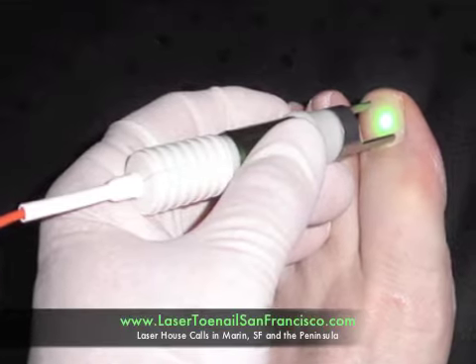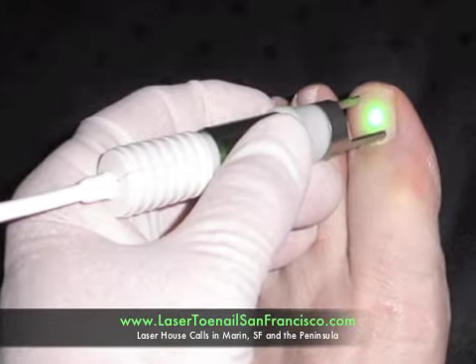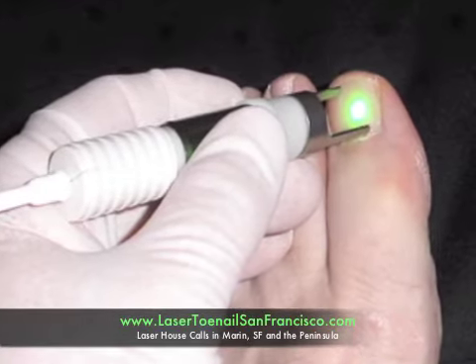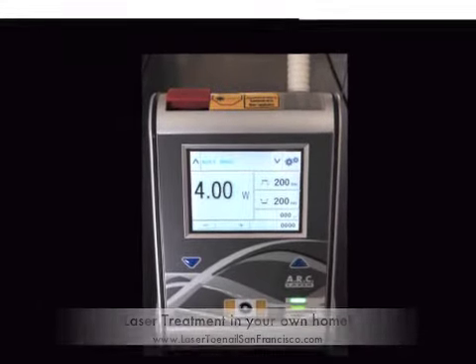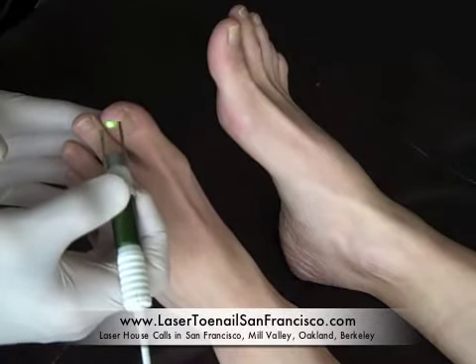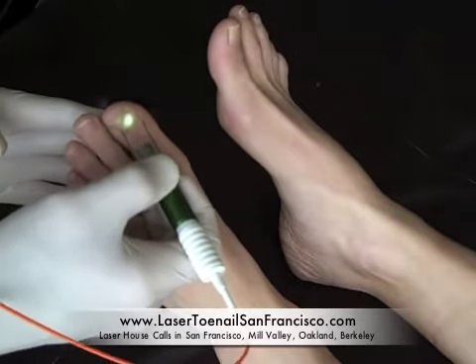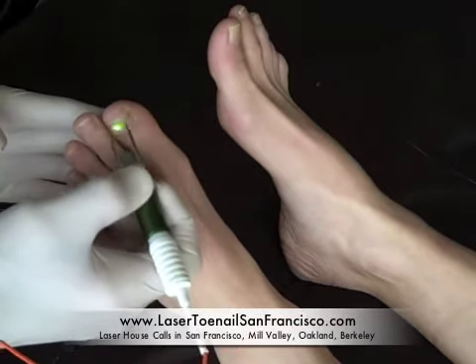Laser treatment has been shown to be effective at removing toenail fungus. The laser that is used to treat toenail fungus is a 1064 nanometer wavelength YAG laser. The way that the toenail laser works to remove the fungus is that it delivers laser light energy to gently heat the toenail bed and kill the toenail fungus and fungal spores. Unlike many other toenail fungus treatments, the laser penetrates all the way through the thick toenail to reach the toenail fungus. The laser actually directly damages some of the components of the fungal cell membranes, which causes them to die.